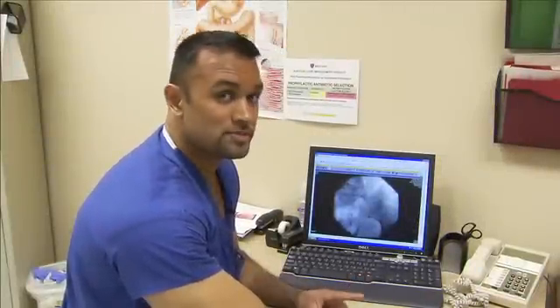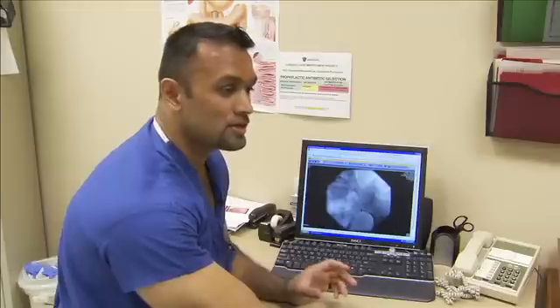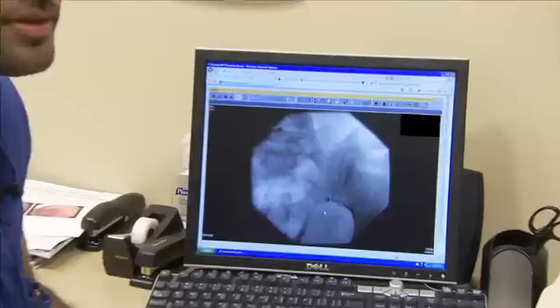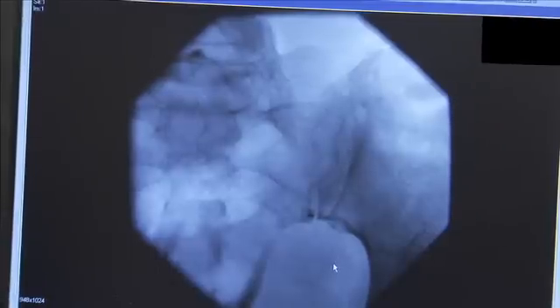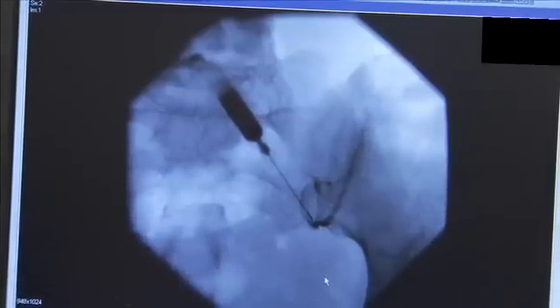All finished. I just wanted to point out a few distinct differences between the diagnostic injection you just saw compared to this patient. On the first patient, the contrast was only going into the posterior part of the SI joint. In this diagnostic injection performed just recently, you can see it going through both the posterior and anterior SI joint. Here's a picture of the needle in the distal third of the SI joint in the posterior aspect — mostly located along the medial aspect — while this joint space is the ventral aspect. As the contrast extravasates, it actually goes up along both the posterior contour and the anterior contour of the SI joint.